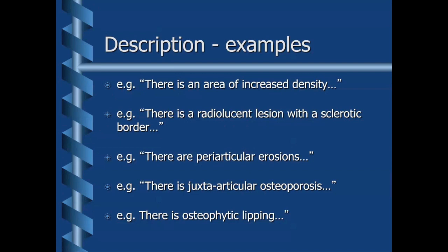You need to be able to use this terminology to enable either another podiatrist or another health professional to understand exactly what you're talking about. To do that, you need to use the most appropriate term at the appropriate time. You can't just say there's a dark area or a light area, or there's bits missing around a joint, or there's some fuzziness underneath the joint, or some lumpy bits here or there. That's just not good enough.